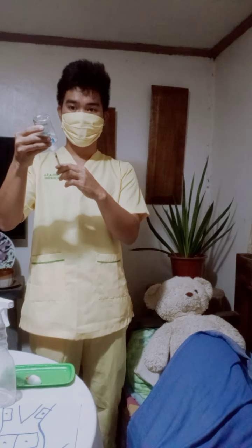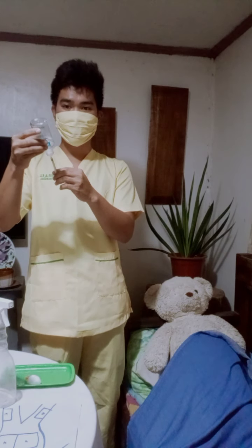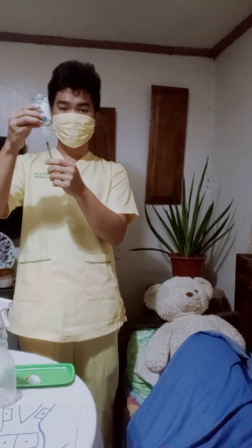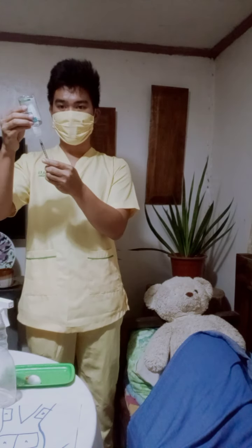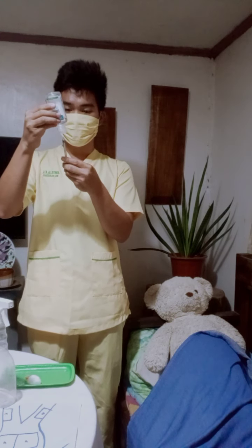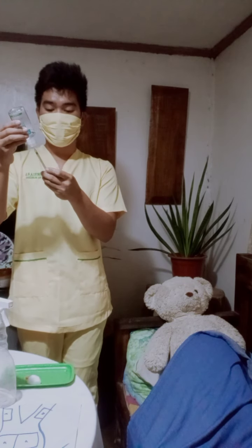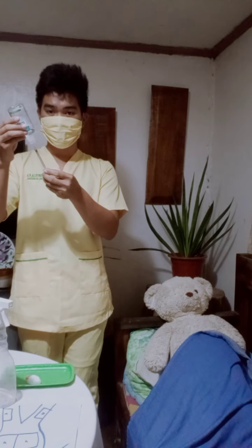Or push it back into the vial and hold the syringe and vial together upside down and get the desired dose. For example, if we need 20 units, then we're going to pull back 20 units, like what we did when we pulled the plunger earlier. So we're going to get the desired dose while pulling it using our dominant hand.